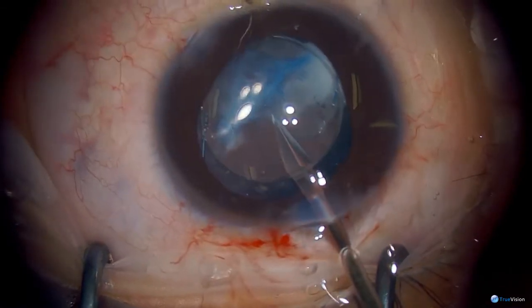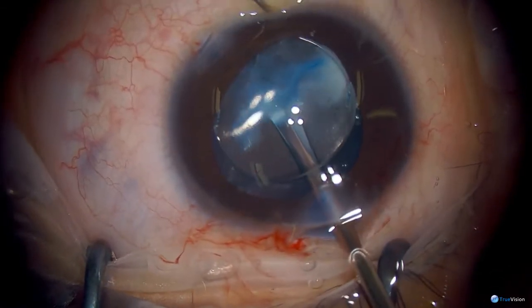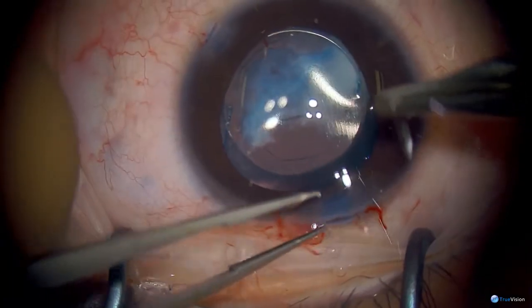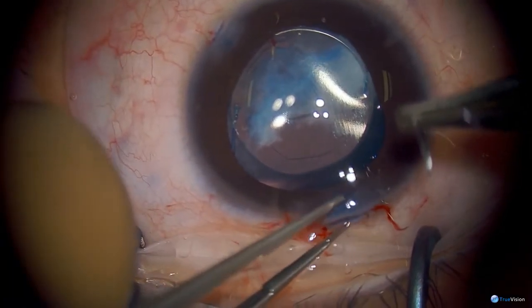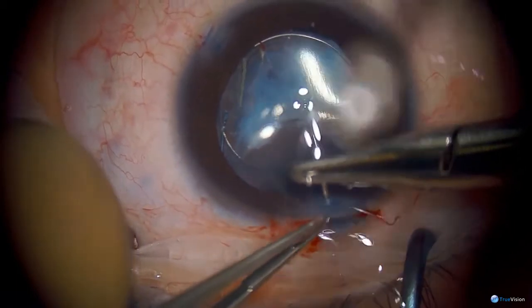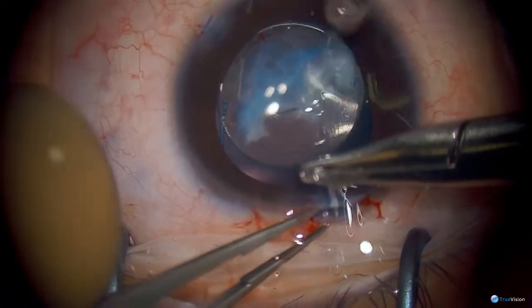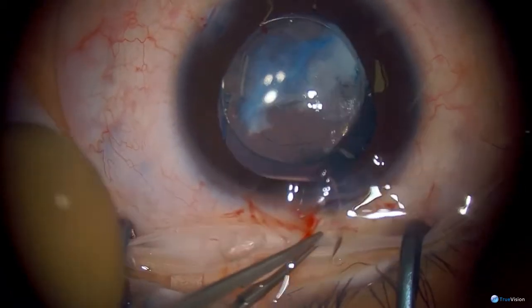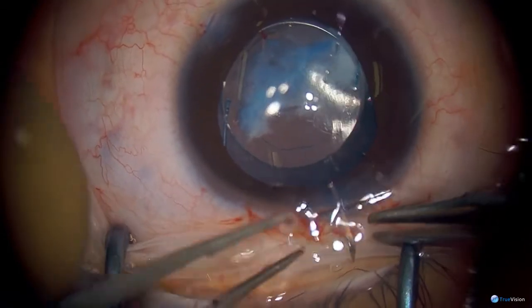So right now, going underneath to make an opening in the posterior capsule. When the incisions are smaller, there's a much more stable chamber. So I'm trying to close the large incision somewhat. And because I enlarged the wound, I'm going to put in 3 sutures in total.